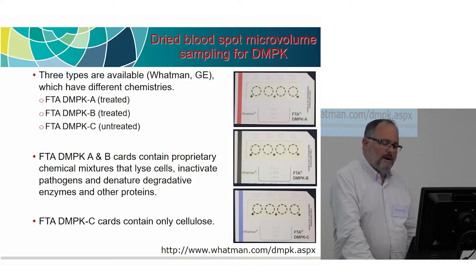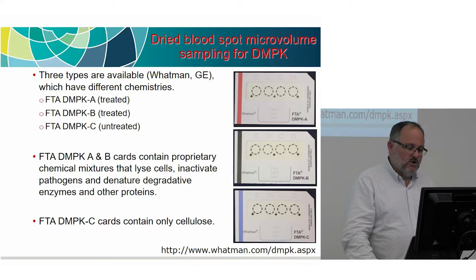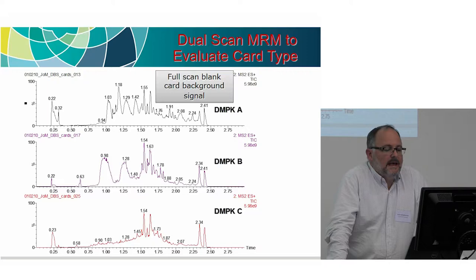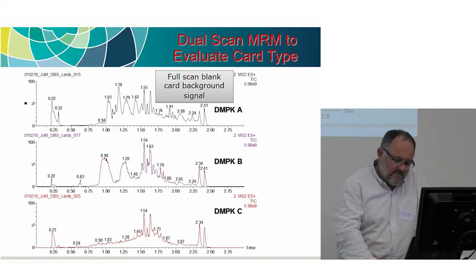I'll quickly talk about what I said before about cards having an effect. I've got some Whatman cards here — some are treated, some are untreated. Some are treated with chemicals that lyse cells, inactivate pathogens, or degrade enzymes. What we have here is three cards and we've done a full scan of the background signal. There's an enormous amount of extra things coming off these cards — and these are cards with no samples, just the proprietary treatments on the card. We've got to look at whether that impacts our chromatography and results. It's another variable to consider.